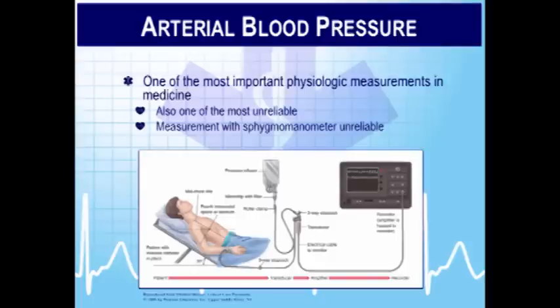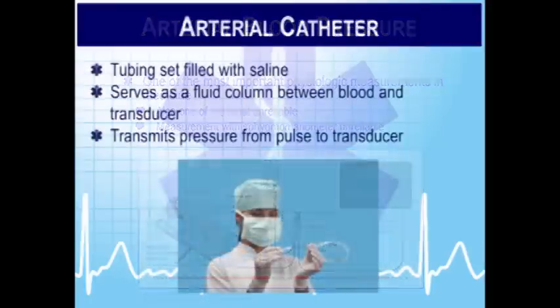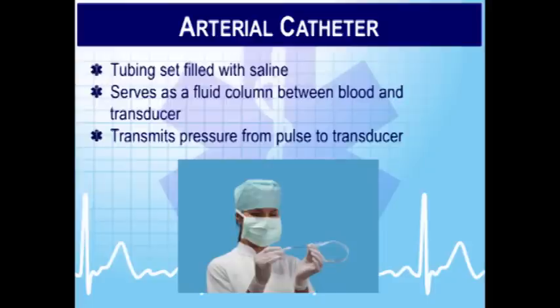I've got the fluid bag under pressure. The fluid bag under pressure needs to be at 300 millimeters of mercury. So that's really why you have that little gauge on those pressure bags, when you're using a transducer system. When that thing is pumped up to 300 millimeters of mercury, that transducer will infuse at 3 mLs per hour automatically. So that's done to keep the line patent. All right.